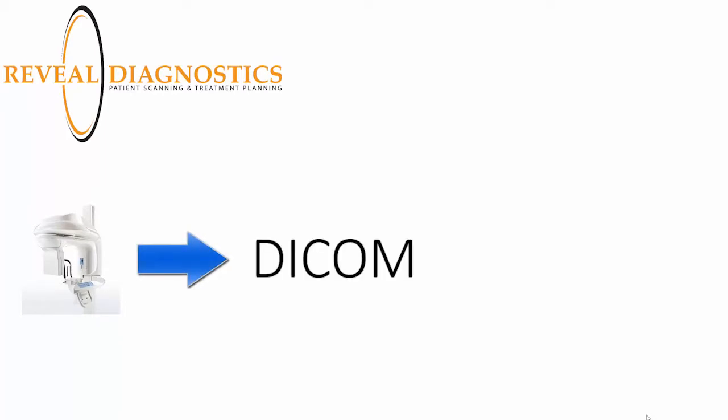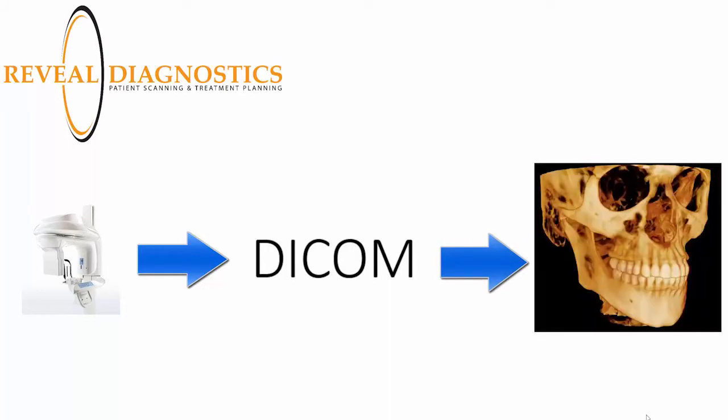At Reveal Diagnostics, we scan for a number of different surgical guide companies. As a scan center, our CT machines create DICOM images, and DICOM is a universal file language for CT scans, similar to, say, a JPEG, which can be viewed by third-party software. So with a CT machine with a high-quality sensor and a full field of view, we have the ability to scan for any guided surgery system.